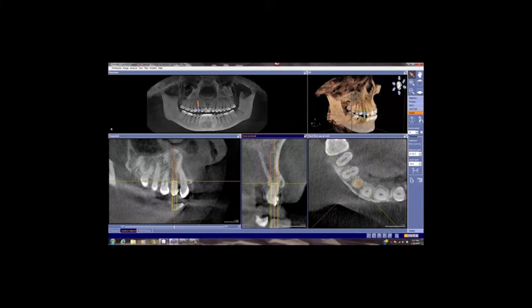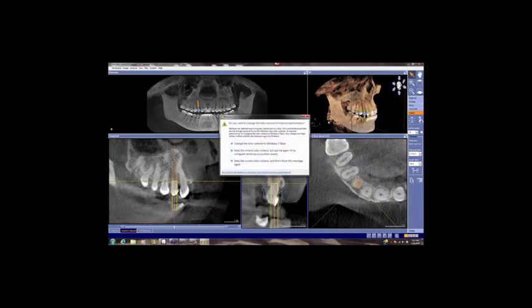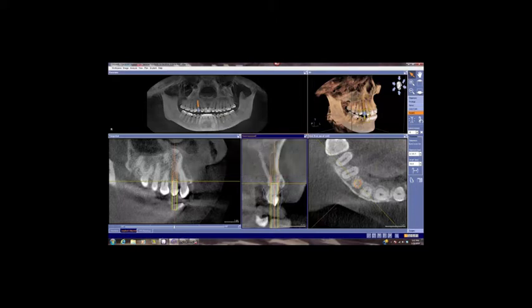A 3.3 implant would still require bone grafting, and a shorter implant would not engage enough of that apical bone, especially since we are going to immediately provisionalize this case. We want to gain as much stability as we can. So this is the plan. So you can see here what nuances go into planning a case like this, ideally and optimally for an optimal outcome. With this plan now, we'd send this case to have an OptiGuide fabricated.